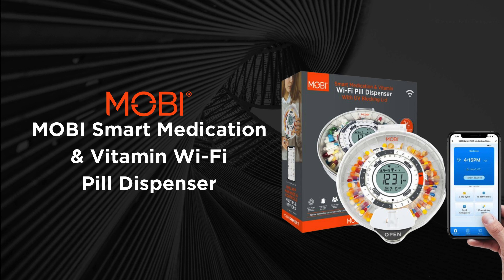Hello! In this video, I will talk about how our Mobi Smart Medication and Vitamin Pill Dispenser can benefit your daily lifestyle or benefit those in need. I will also demonstrate how simple it is to connect the pill dispenser to your smartphone and how to set it up without a smartphone.